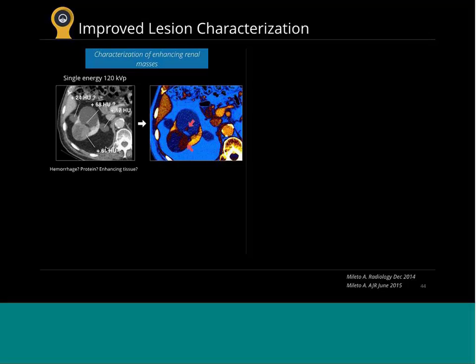Okay. So sometimes we have patients with like 10 lesions bilaterally. Forget trying to figure it out here. Even if I had the true unenhanced exam, forget trying to do the post-con attenuation and the pre-con attenuation. Just look at this. Within a matter of seconds to a minute, you can figure out which is abnormal and which is not abnormal, okay?